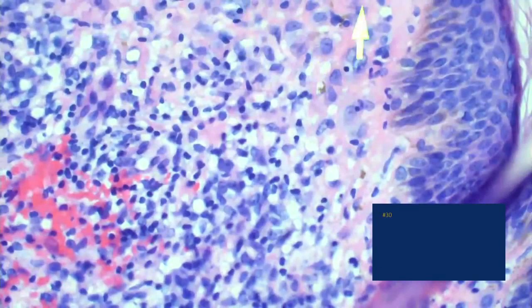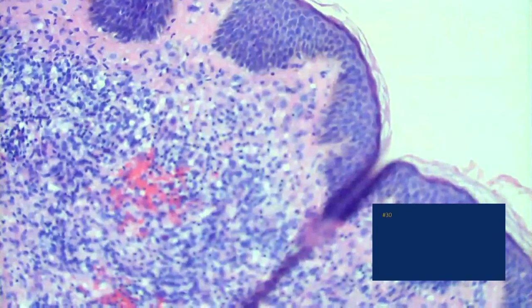You gotta have really sharp eyes. Yeah, I couldn't really put together like a nevus or something like. I was trying to look for like. There's some halo nevus. Good, that's great. That's exactly what it is. It's a halo nevus. These are really the nevus cells here. Which ones? That's right here. Oh, those. And sometimes when it's so inflamed, it's very difficult to see the nevus cells.